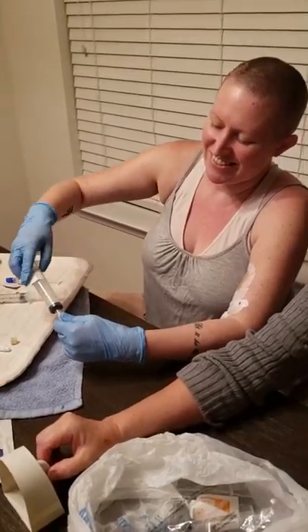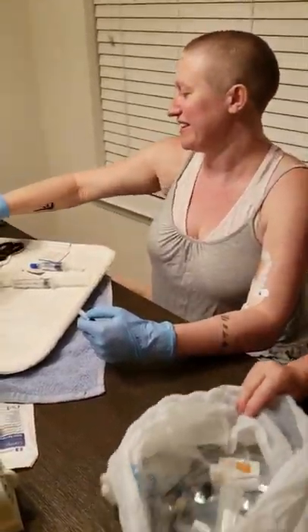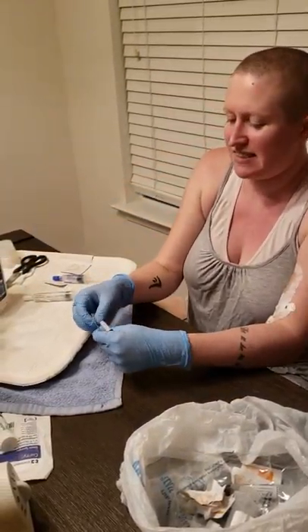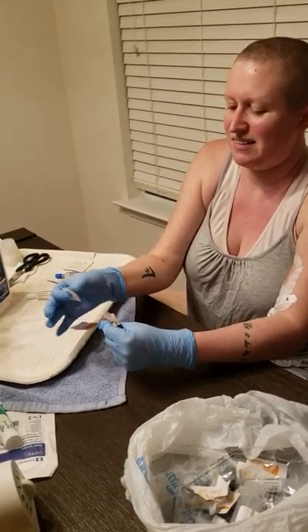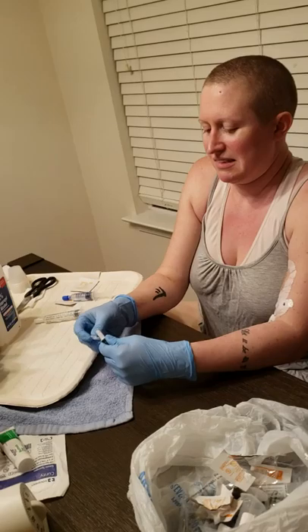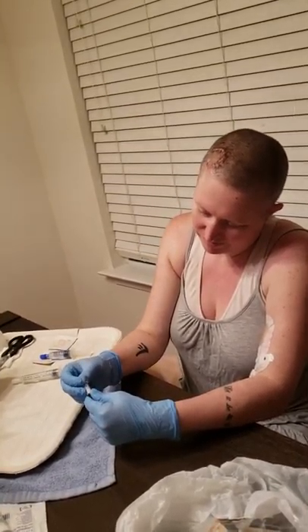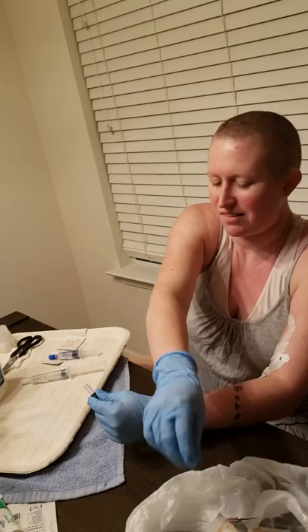We're back — it's been a time-lapse, 10 minutes. So we're back to alcohol wiping again, and then after the antibiotics she'll get another saline flush. It's exactly the same as the very first one. Almost all is processed. We're contributing to the makers of alcohol pads. I can do it without squirting it this time. There you go. Perfect.